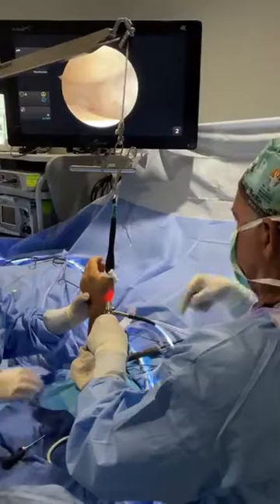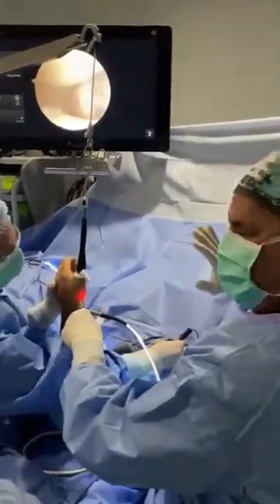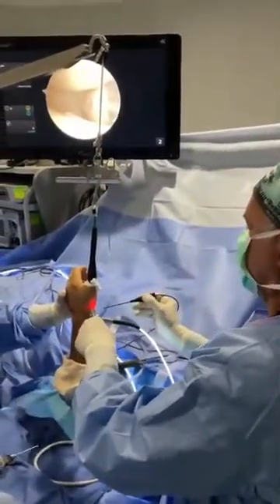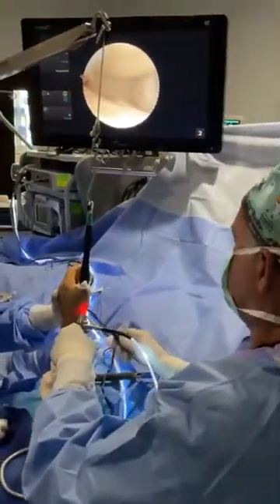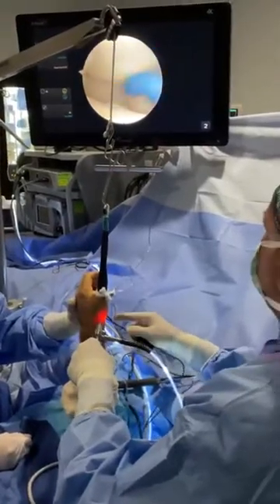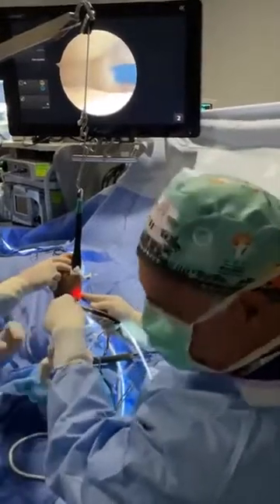Let's do RF since we're on this side, and then we'll change portals. You always need a plain x-ray because that will show you if there's arthritis. But what you really need is a physical examination by someone experienced in this particular area. That's like anything else in medicine. So now this is the radio frequency shrinkage probe.